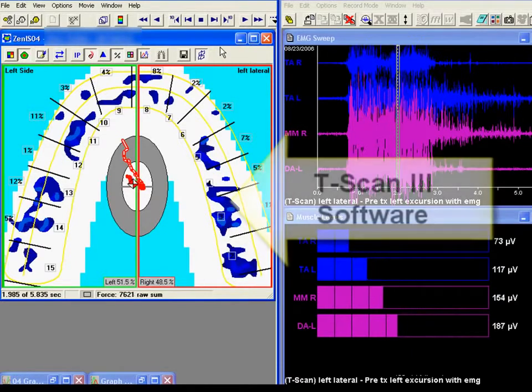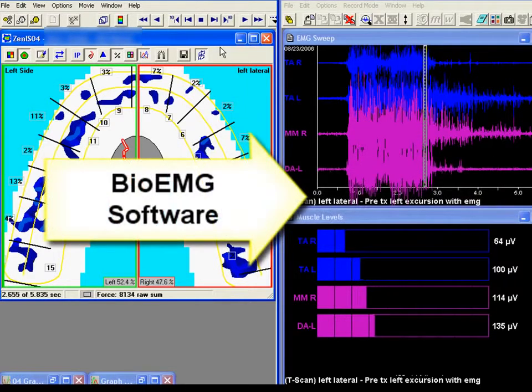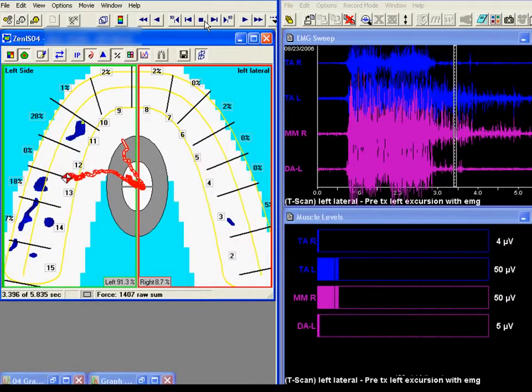In the next few slides, you will see an example of long disclusion time and the effect it has on muscle activity. This patient is Class 1 post-orthodontic and suffers from myofascial pain dysfunction syndrome. We will also do a post-operative comparison to see how the patient improved after the clinical adjustments.